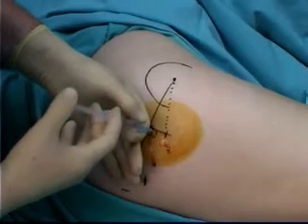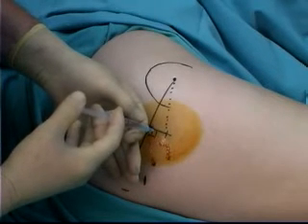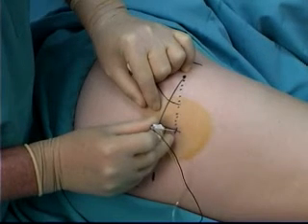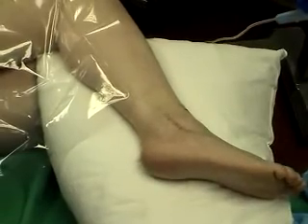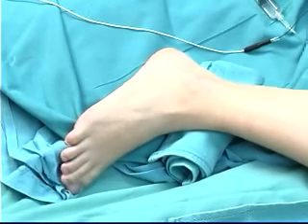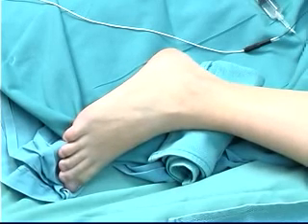After disinfecting the skin, the skin and subcutaneous tissues are infiltrated with local anesthetic agent. The 22-gauge 50 to 100 millimeter stimulating needle enters the skin perpendicular to the skin until the sciatic nerve is stimulated. If the medial aspect of the sciatic nerve is stimulated, the motor response will be plantar flexion of the foot. More lateral on the sciatic nerve, the motor response will be eversion of the foot. Injection of local anesthetic agent or normal saline will cause the muscle twitches to stop immediately.